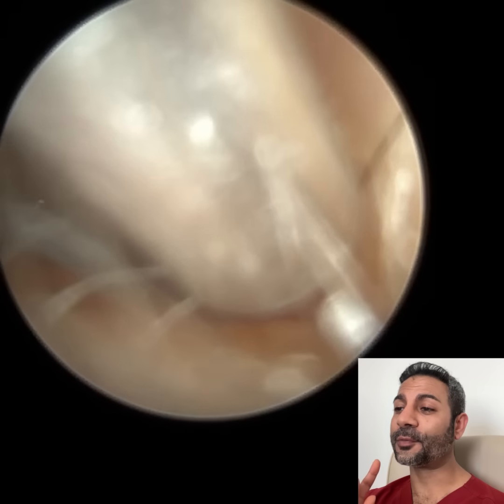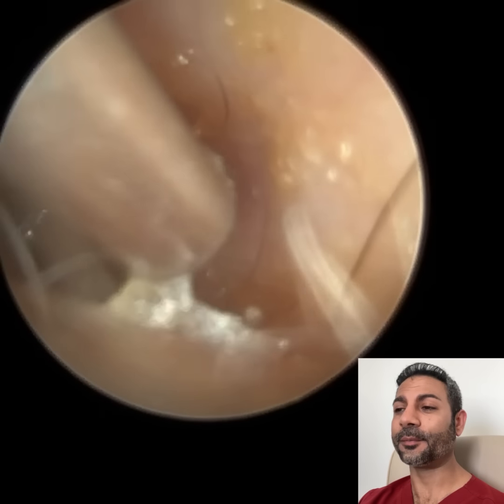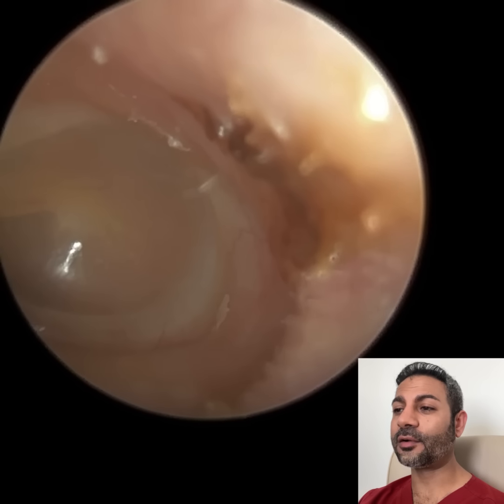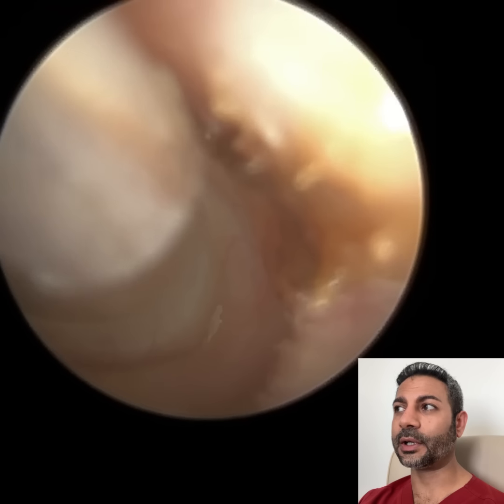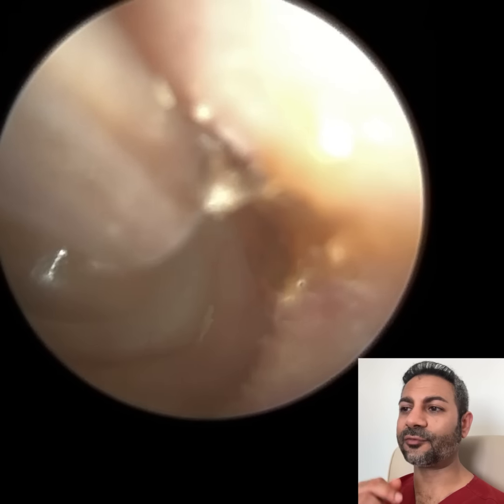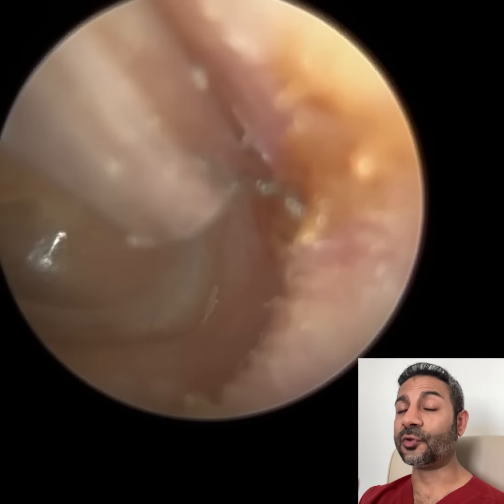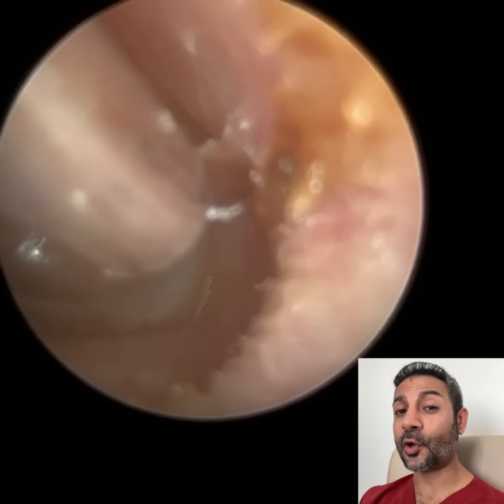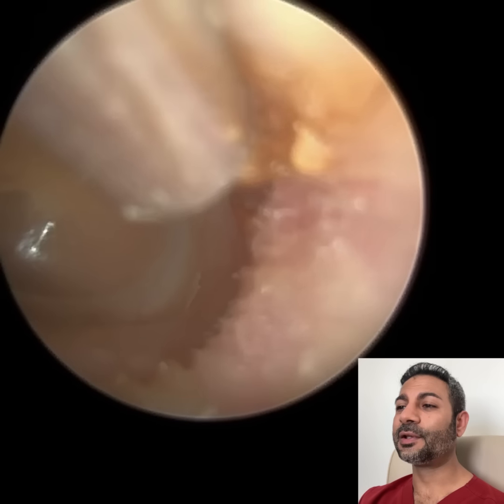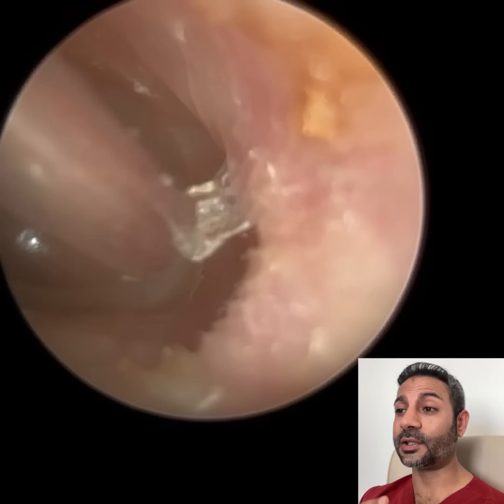Fortunately for the patient, his wife's a GP, although I don't think his wife is his GP, but she can perform otoscopy and keep an eye on it, because fungal infections are hard to overcome. Normally, over-the-counter treatment in the UK, you use some particular drops. You have to use it for 2 weeks, get your ears re-examined, and continue to use it until it's resolved. Once it's resolved, you're then meant to use it for another fortnight, just to prevent a relapse. Now, this patient in the past, when he got a syringe, he did suffer from a vasovagal response, where he almost physically felt sick.